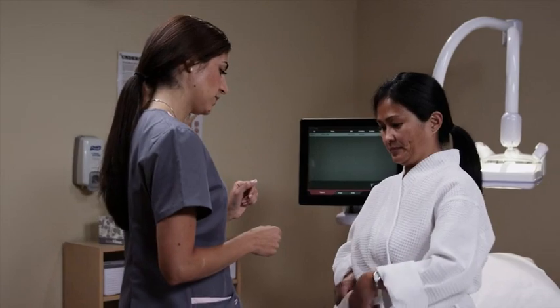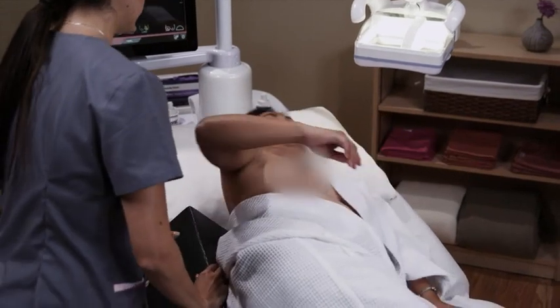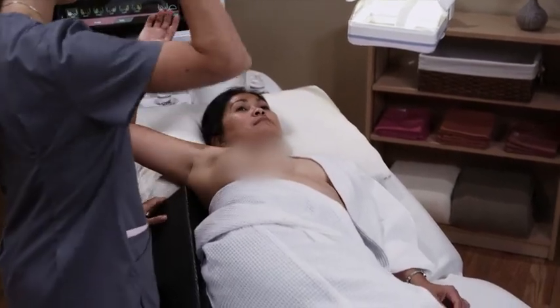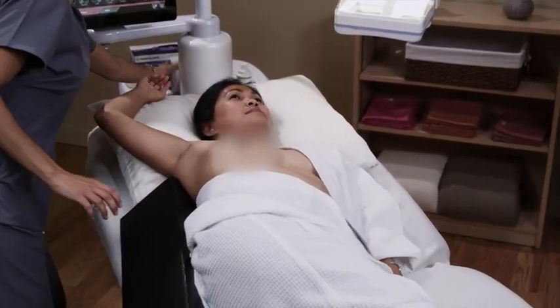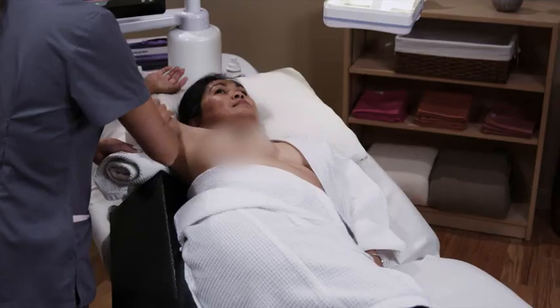You'll be asked to wear a gown with the opening in the front and lie on your back. An angled sponge may be placed behind your back and hips. A rolled towel may also be used behind your shoulder to help place you in the proper position. This position helps evenly distribute your breast tissue to enable the Invenia ABUS system to scan your breast.